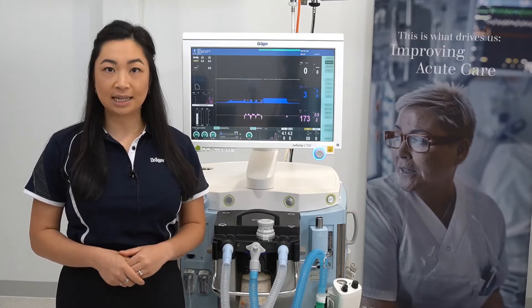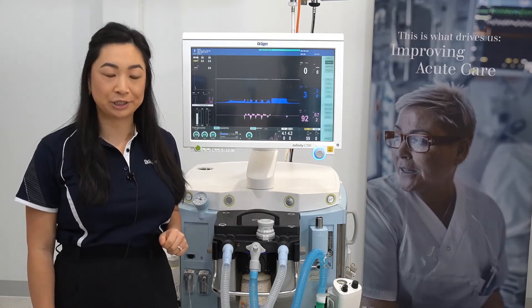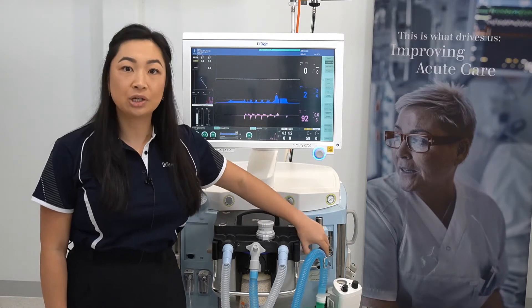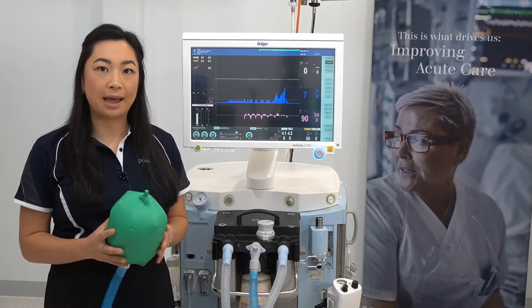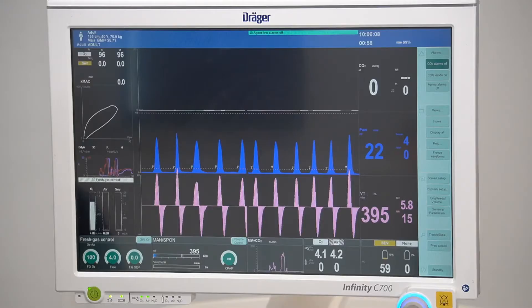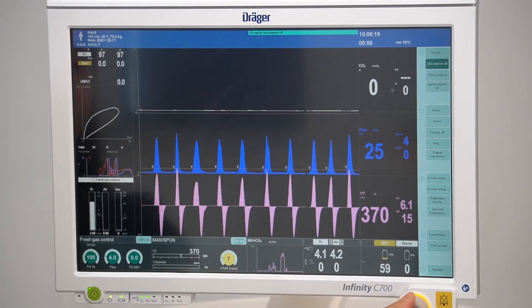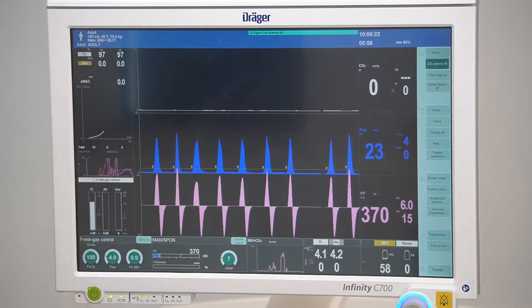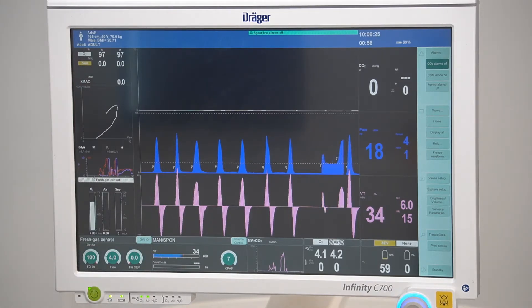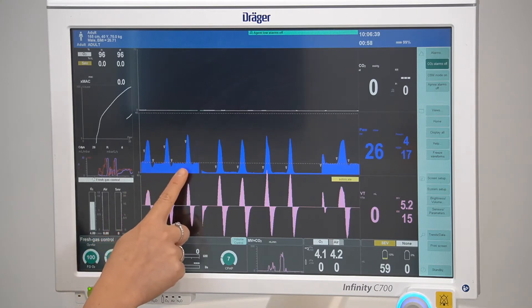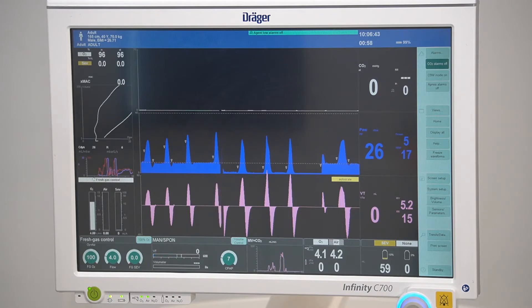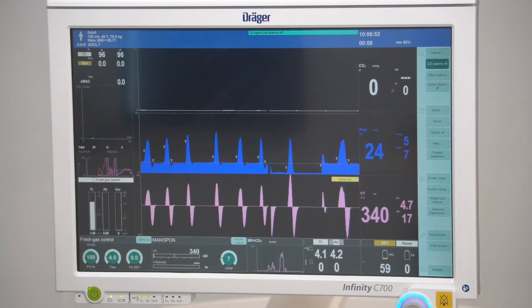During manual ventilation, set the APL valve to the desired inspiratory pressure and start manually ventilating the patient via the breathing bag. To avoid the expiratory pressure going down to zero, a CPAP can be applied. Here you can see the CPAP function being applied during manual ventilation. The APL setting defines the inspiratory pressure and the CPAP setting defines the expiratory pressure in this situation.